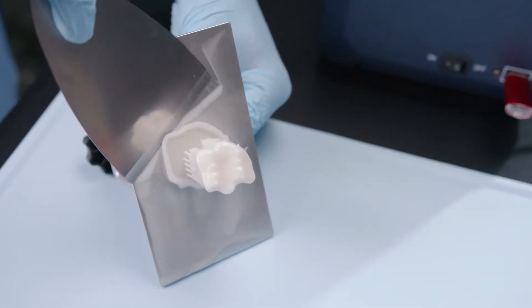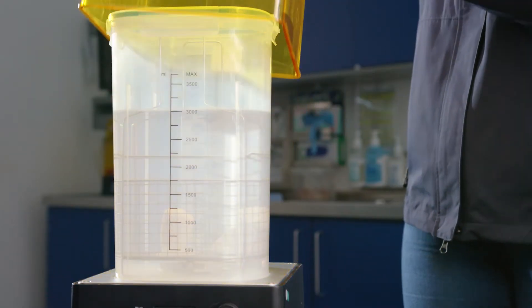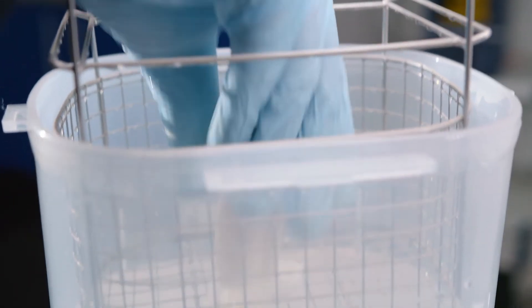The post-processing station is required for this. The corresponding container must be filled with approximately 3,000 milliliters of isopropanol 99.9%. The printed tooth can be detached from the metal base with the spatula and placed in the small metal basket in the container filled with alcohol.